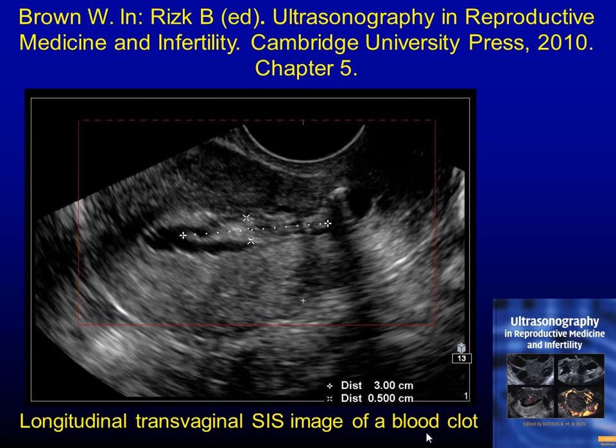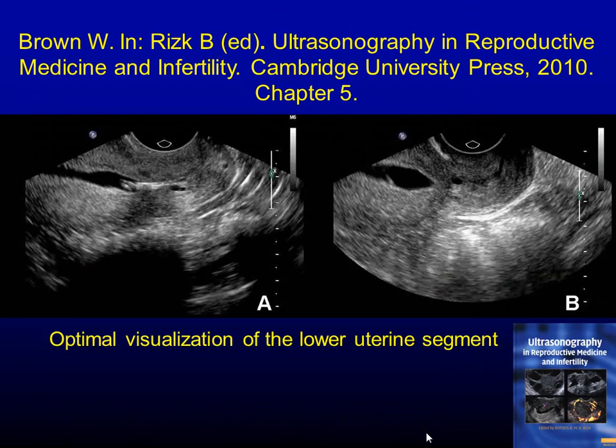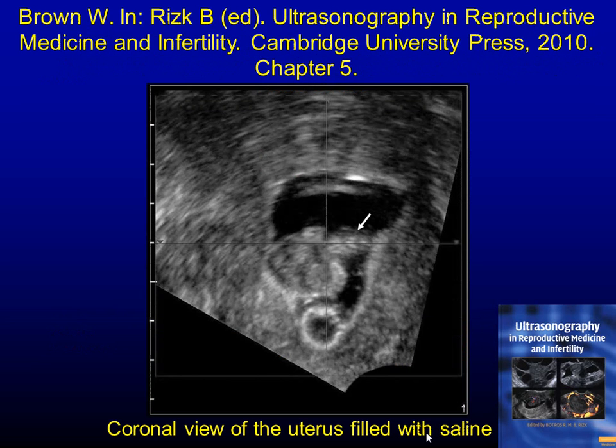This patient looked like she has a bad uterine mass here, so the mass extends from here. All this was menstrual blood. We waited 2 days later, and she had a repeat sonohysterogram, which was perfectly normal as well. If you want to check a lesion in the lower segment, then you have to deflate the balloon and pull it down. There are 3 views on the 3D ultrasound.